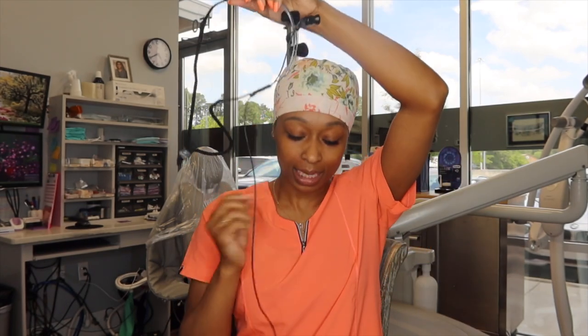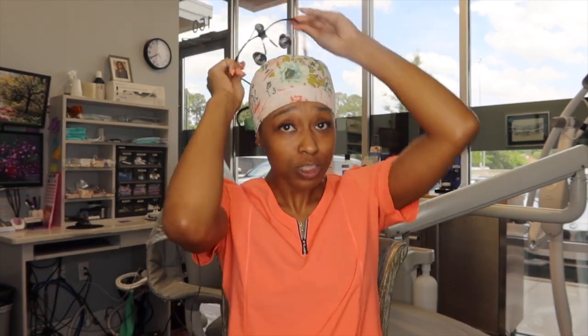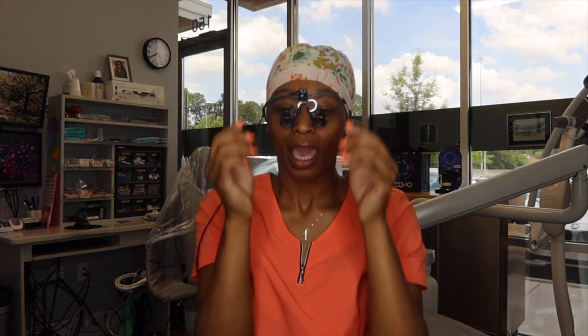Lastly, I want to go over loupes. I was introduced to loupes while I was in dental hygiene school. I haven't worn these in about two years because my battery has been messed up and the light doesn't get very bright. But the difference between loupes and regular protective eyewear is that here you can see there's magnification — it puts the teeth right in front of you. Although you may be a distance from the patient, it magnifies and brings it right up close.